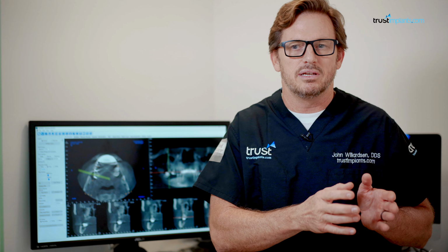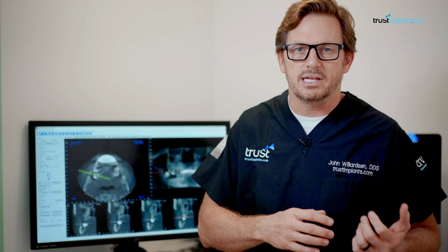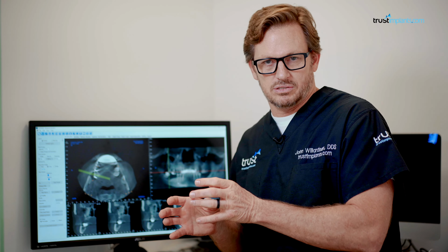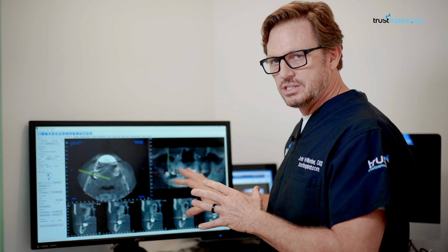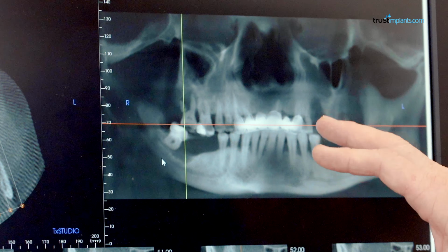We're not going to match the aesthetics of the teeth that we pull out, but just how it feels and the amount of bone reduction and where the implants go and the design of the case. We want to try to mimic nature, biomimetic, as much as we possibly can. And so therefore we treat each case accordingly. All right, so here we have our before CAT scan.